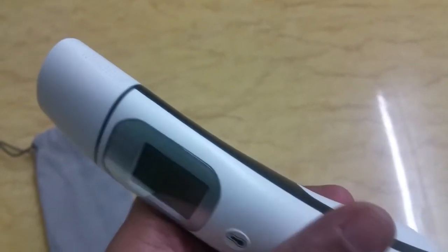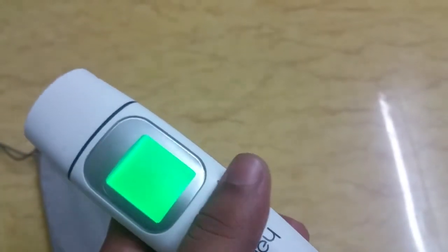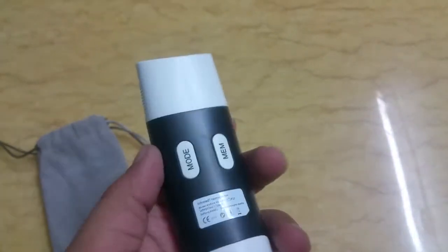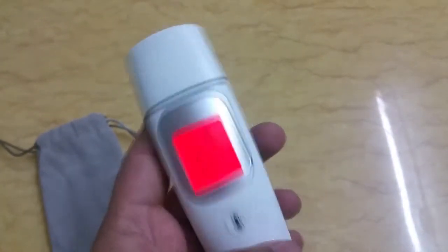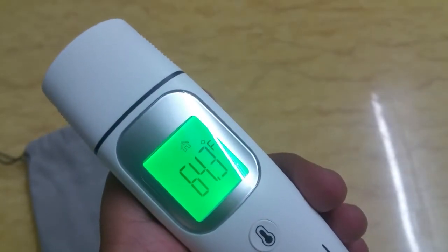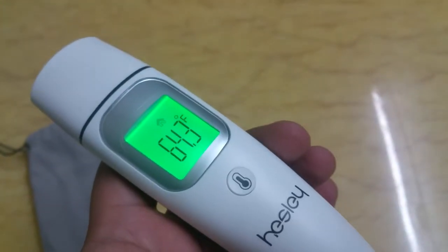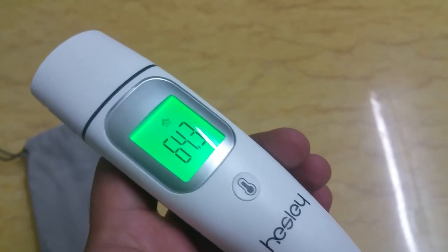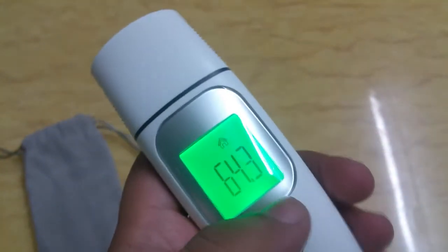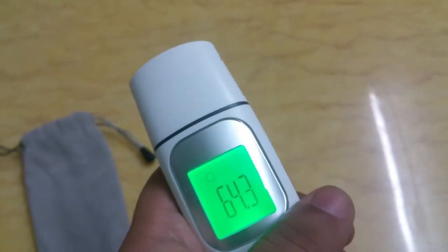If you click the mode button, you can toggle between body temperature and room temperature. Using it is very straightforward — just select your mode and tap the button on the front fascia. It's pretty much instant: once the logo is shown, press the button and the temperature will be displayed.